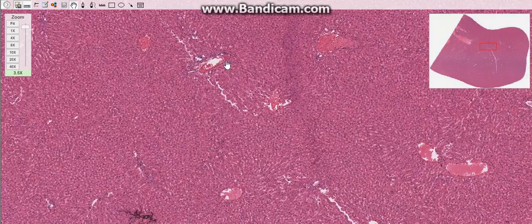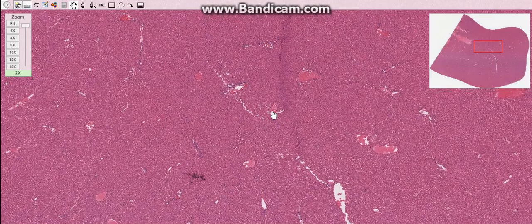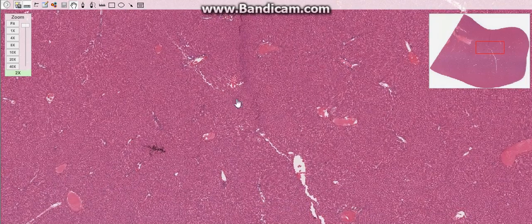So this is the portal triad, and there is also a very common concept of liver lobules. The classic liver lobule, as I said, is hexagonal in section. In the center of the liver lobule, there is the central vein, as I said before, and at the corners of the lobule, there are the portal triads. The blood flow is directed from periphery to the center, and bile from the center to the periphery. So this is called the classical lobule.